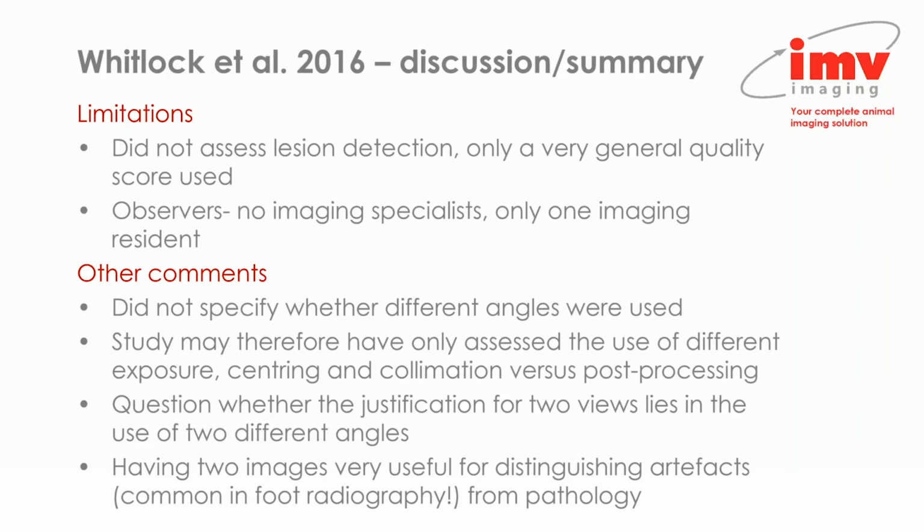And so because this study did not use any horses with pathology, we cannot comment on the relative diagnostic accuracy of the two views. They were simply looking at a very general image quality score. Further, the observers didn't include any imaging specialists, so no diplomates of diagnostic imaging, and there was only one imaging resident, and that may have produced some spurious results.